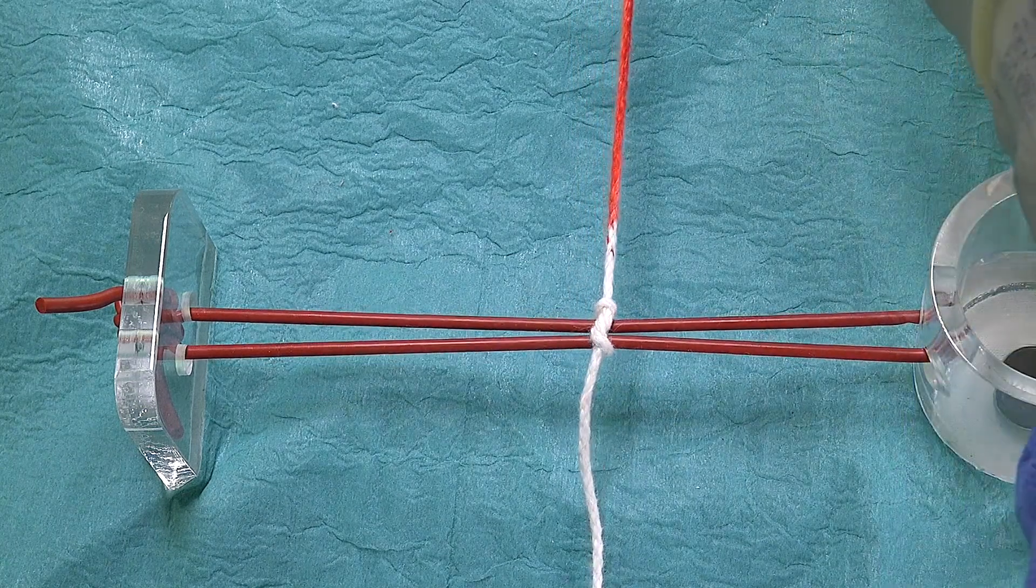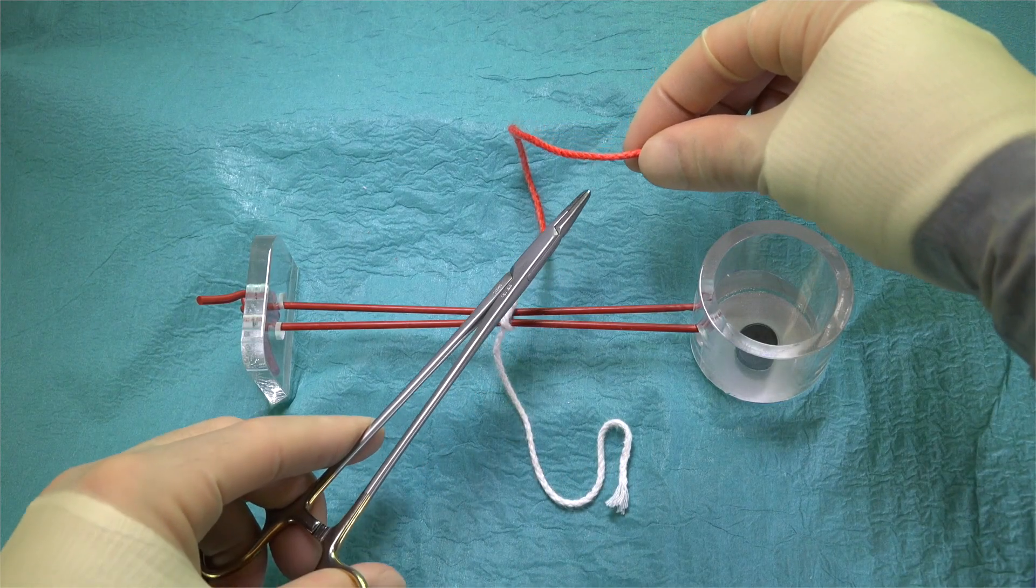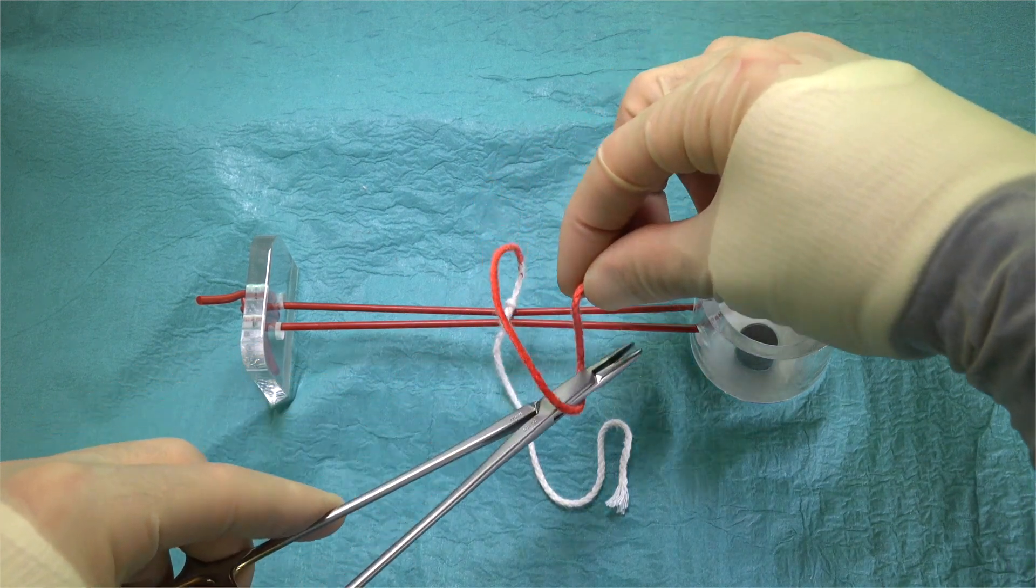The needle holder is again positioned horizontally, lying over the suture. The right hand then loops the suture that lies away from us, over and around the instrument once.